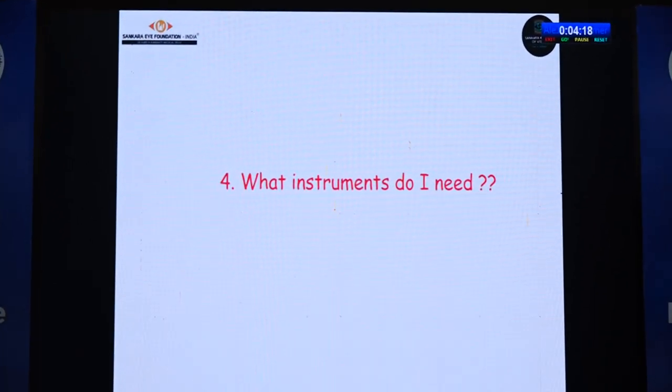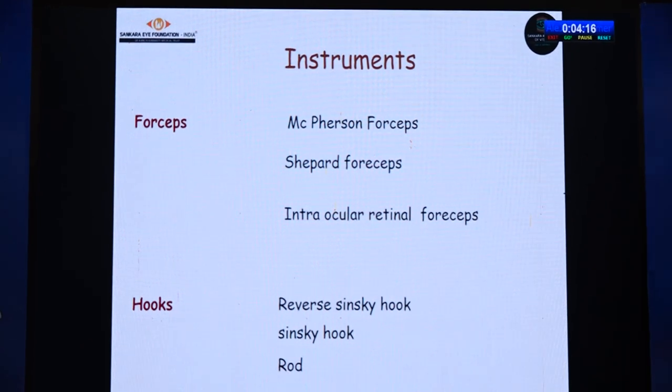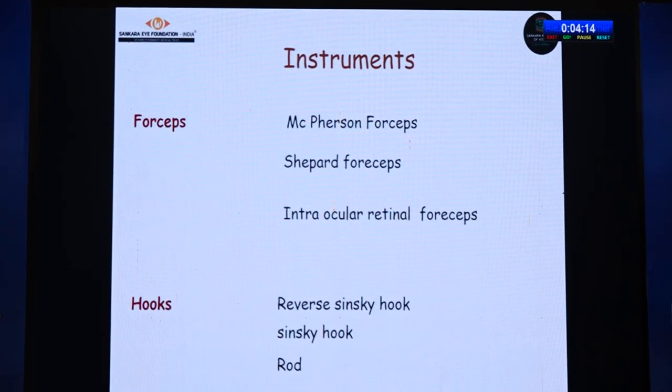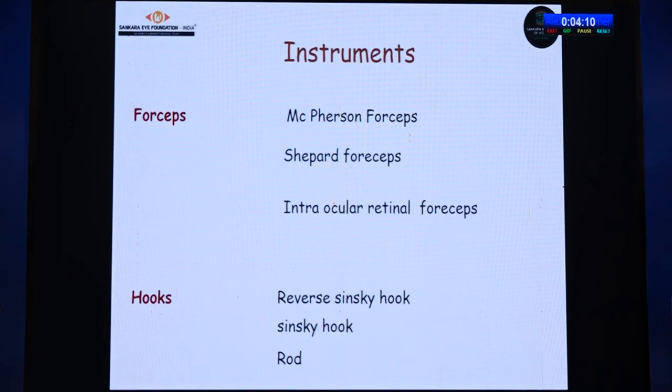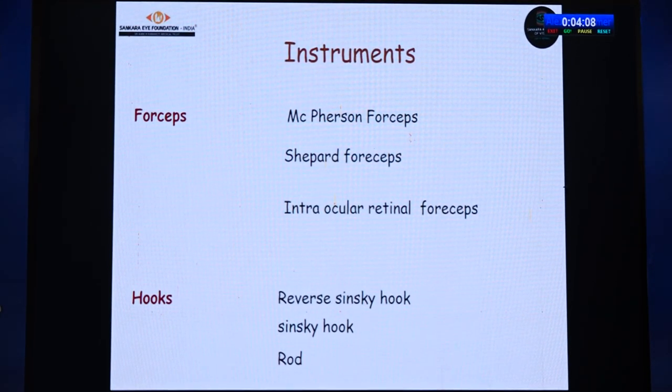What instruments do I need? No need for any extra instruments. I use a Shepard's forceps, which gives good stability. If you don't have a Shepard's forceps, a McPherson's forceps or an intraocular retinal forceps will work. To enclave the iris tissue, it's better to use a reverse Sinskey or a rod, as it is less traumatic to the iris. In their absence, you can still proceed with the Sinskey hook.